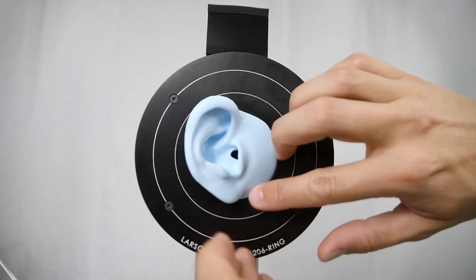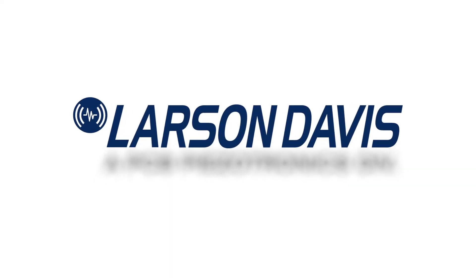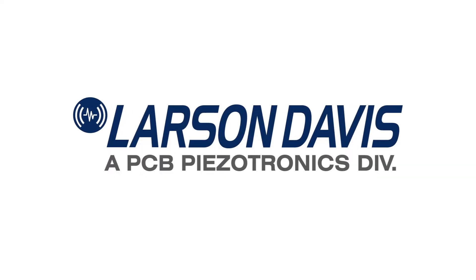To learn more about these procedures and other information related to the AEC-206, refer to the manual located on the USB drive with your device or online at LarsonDavis.com.